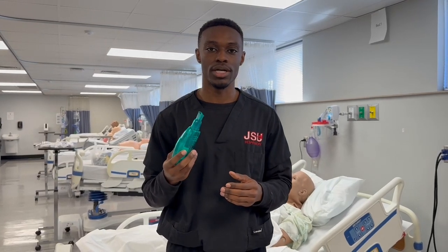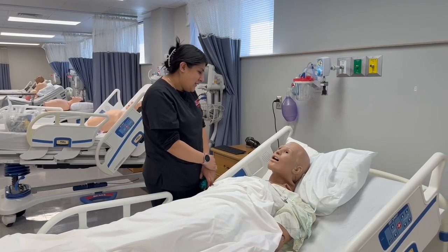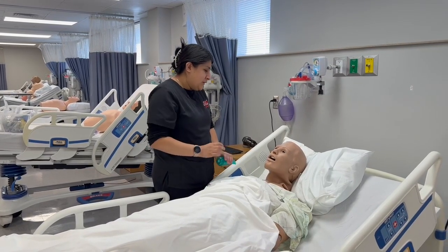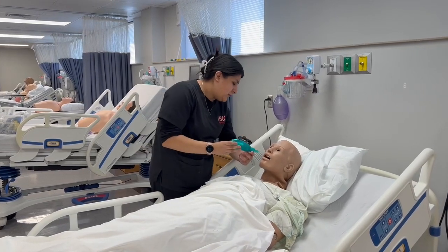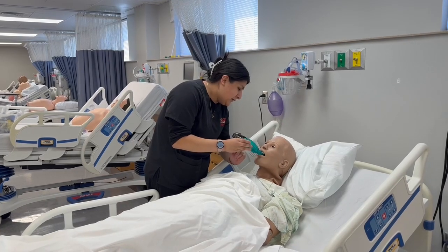The last device we'll be showing an example of today is the flutter valve, which is also used to help mobilize secretions. Hey Mr. Smith, the doctor has ordered you to do a flutter valve — this is going to help break up those secretions. I need you to make a tight seal around the mouthpiece and blow on it ten times.